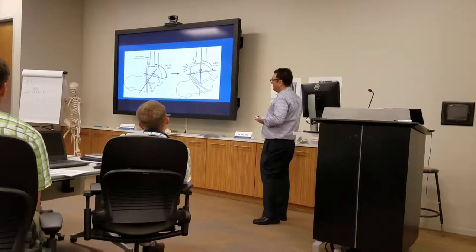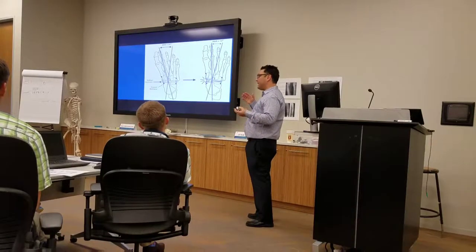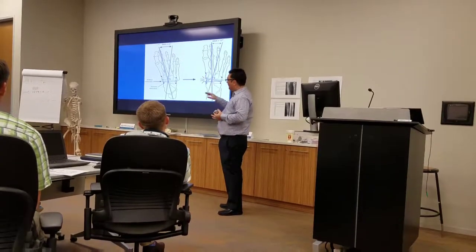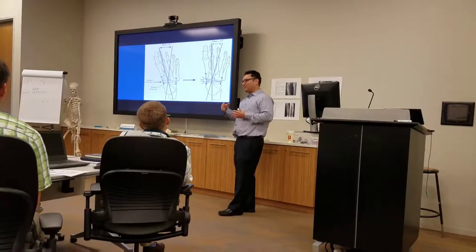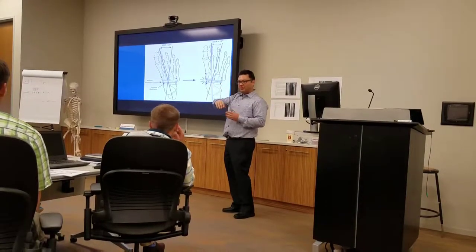So once again, also posterior ankle stretch. Back to the foot. You got a lot of adduction. This is what that patient was. So it's not just the stretch, but that foot, if you want to take it out of that position that it was in, it was adducted, missing that bone over there.